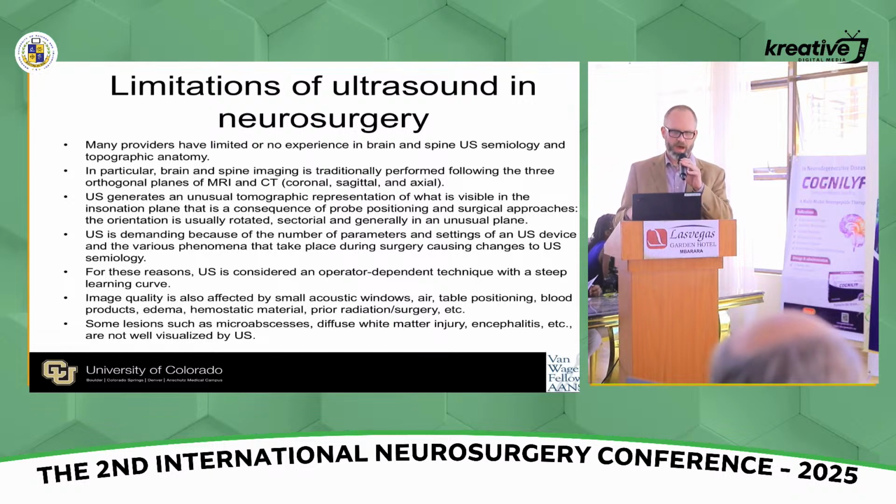And there are some automatic settings. If you set it to abdomen, for example, the abdomen is similar to the brain in terms of settings that you want on the ultrasound machine. So if you start with abdomen, then a lot of those things are adjusted, and then you only need to make 2 or 3 different adjustments in terms of zoom, gain, and frequency. Those are really the only 3 that you need to mess with after setting it to abdomen, at least in the beginning, okay?